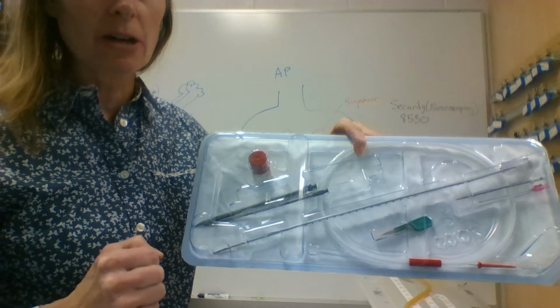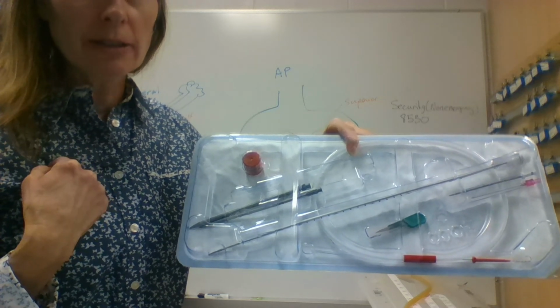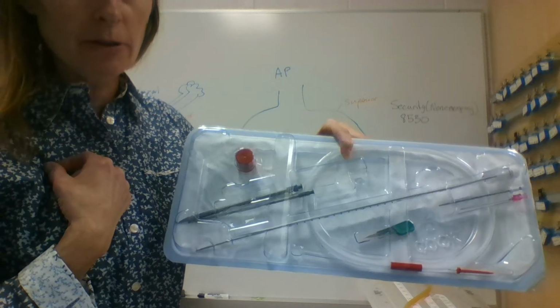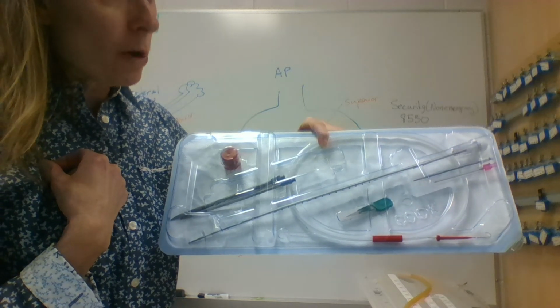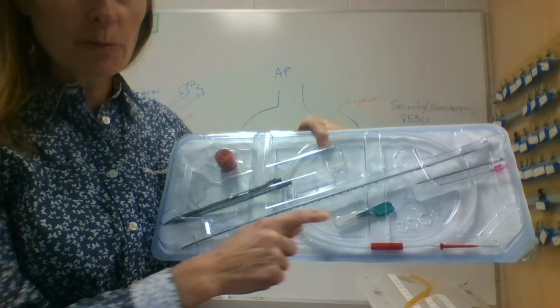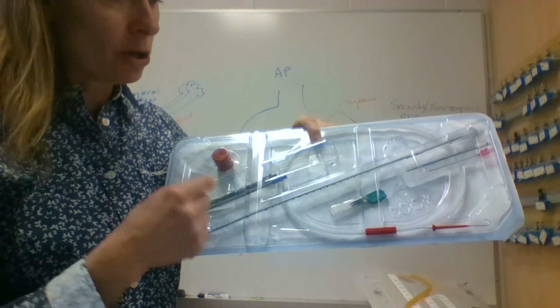So we have a different needle here that we are going to use to freeze the location. So what will happen is the radiologist will put a little X with just a Sharpie on the location. Okay, the radiologist will freeze the area, and this is all done, of course, using surgical asepsis, so sterile technique and that sort of thing. Once that freezing is in place, they'll take the scalpel blade and make a little nick. Okay, it's only a small little cut.